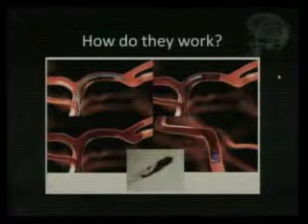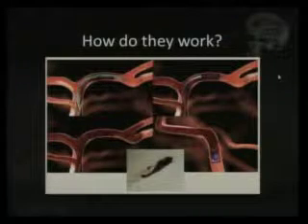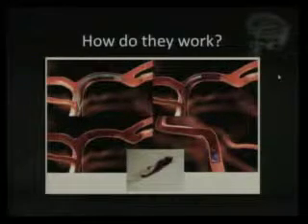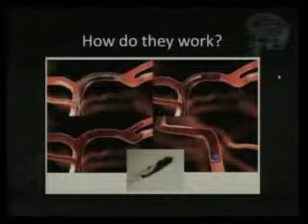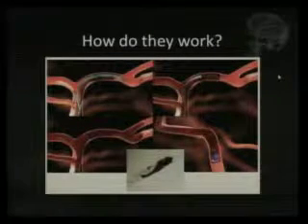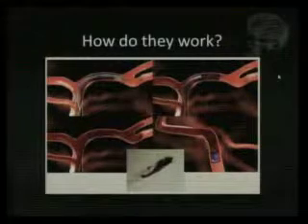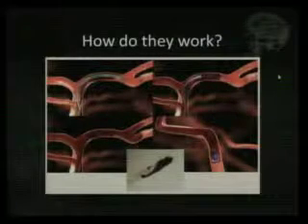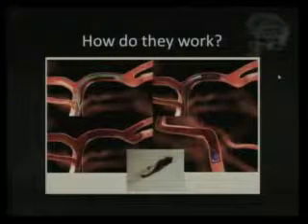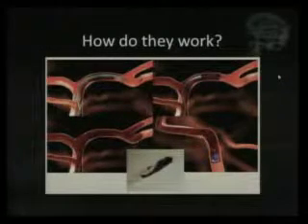How do they work? Well, we have our angiogram. We have an occlusion, let's say M1, like in this case. We advance our microcatheter distal to the occlusion. Then through that microcatheter, we push that stent out. And that stent will start to expand within the clot and cut through the clot until it fully expands. Once it fully expands, we just pull from that pusher wire. We pull the whole system out, the microcatheter, the stent, and we hope that the clot that we cut through with the stent just comes with everything inside that.